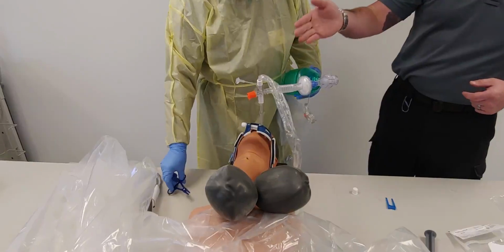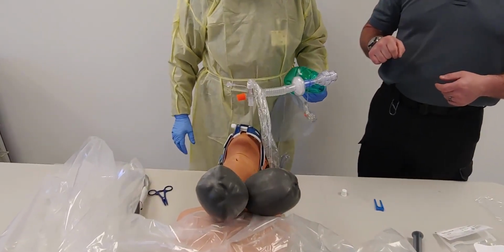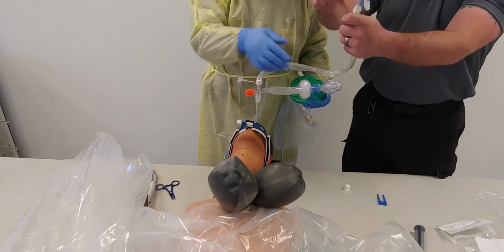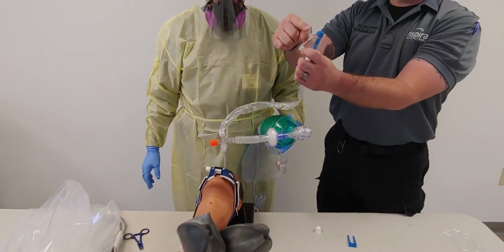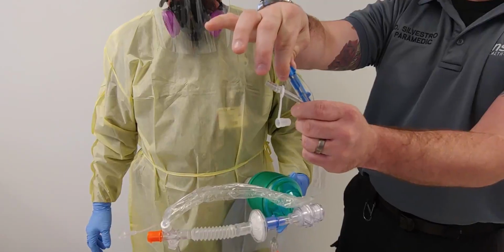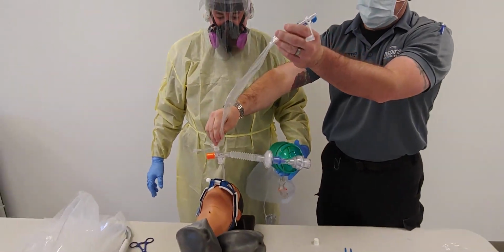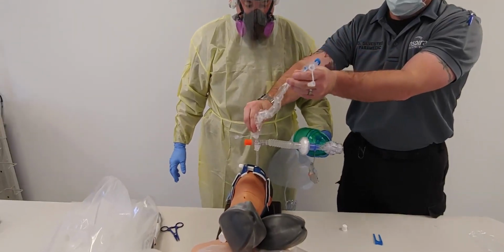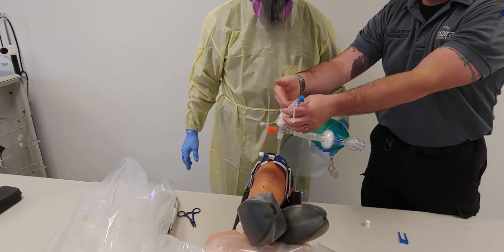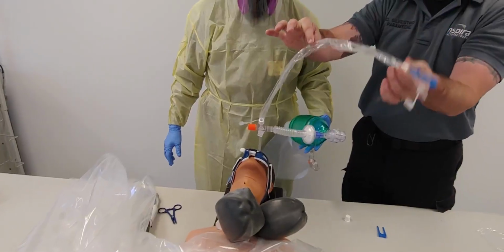Good. And now we go back to ventilation, and we are completely still in a closed circuit here. Now when it comes time to suction, this hooks right up to your normal suction tubing, and this is our on-off. So we put it on, you would suction just like you normally would, slide it down until you meet your resistance. Now it's a mannequin, so we don't have resistance. Suction, so forth on the way out. This keeps it completely contained in here.